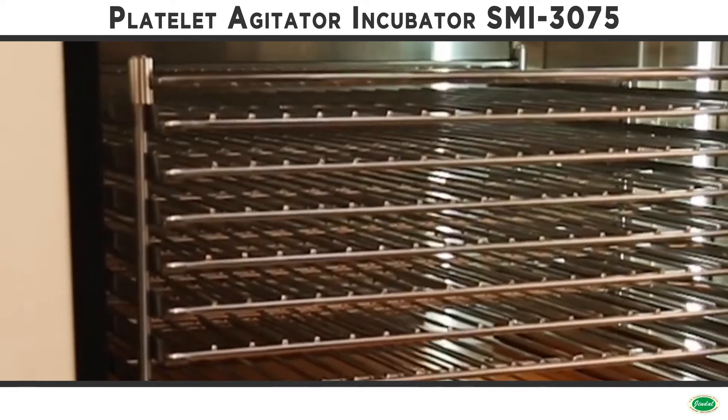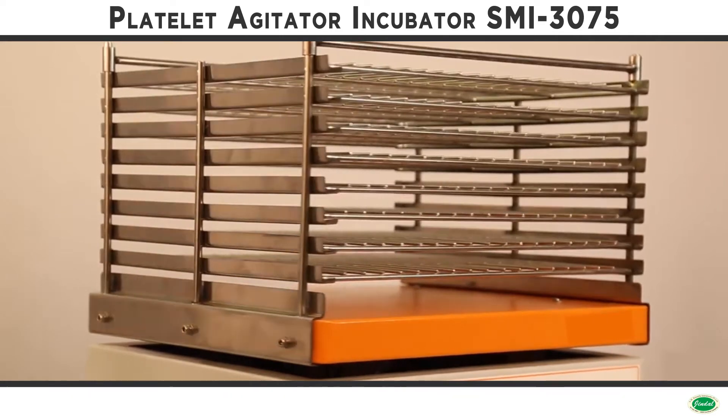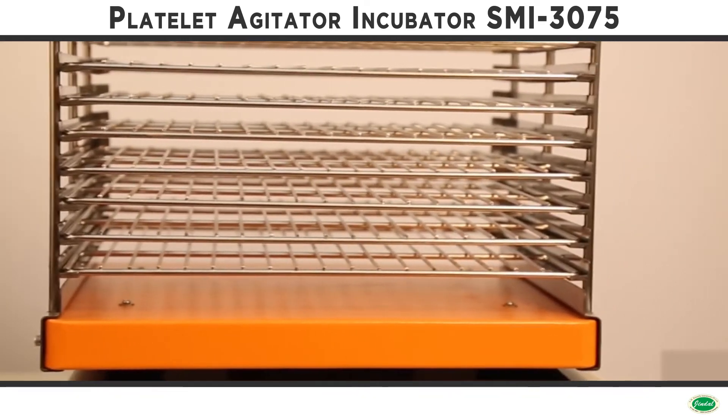Platelet bags are stored on stainless steel shelves. The chamber is insulated with a high-grade, high-density insulation which provides an extremely efficient thermal barrier, ensuring optimum efficiency.